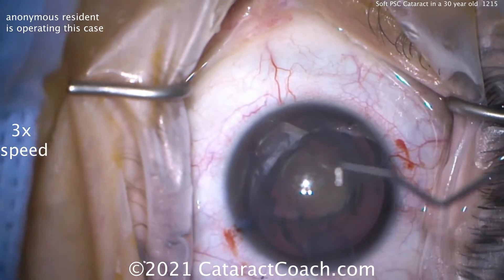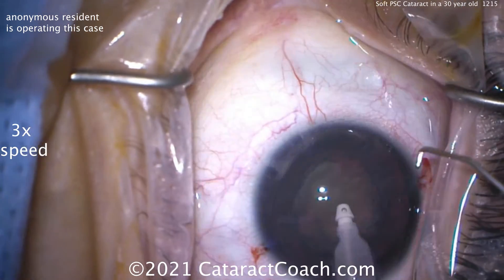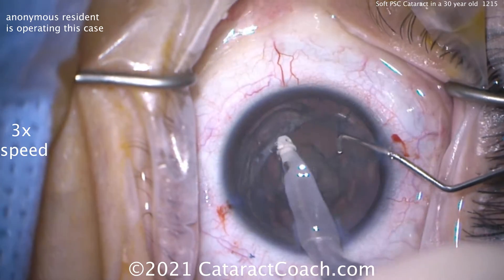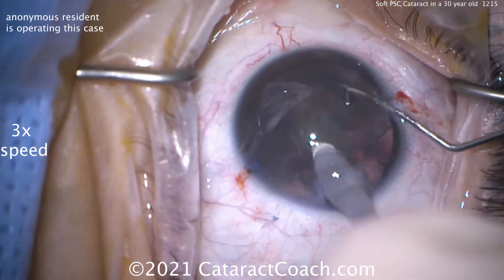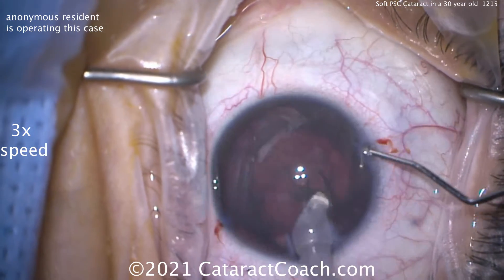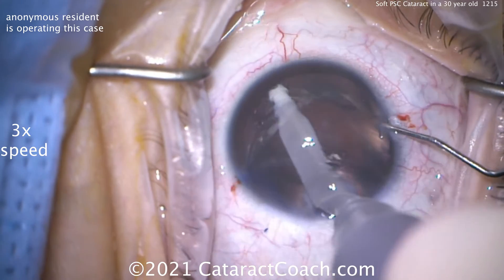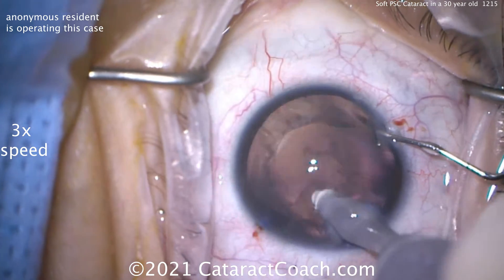This lens is completely soft. You don't need a phaco chopper in this case — you don't even need the phaco probe. Just placing the IA probe in the eye, the entire nucleus is being removed just with the irrigation-aspiration probe. There is essentially no nuclear density here. Removing all this lens material — that looks great. Taking your time. Good job here. And then we'll clean this up.